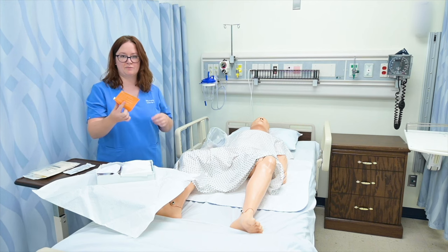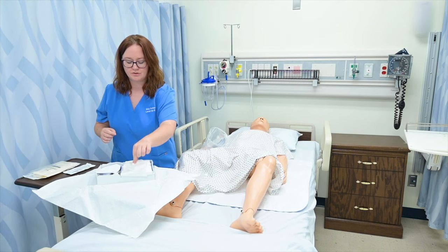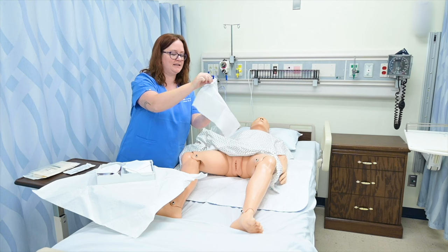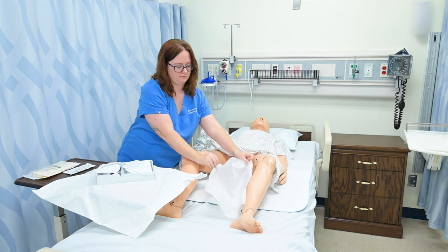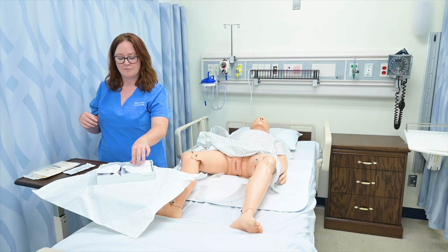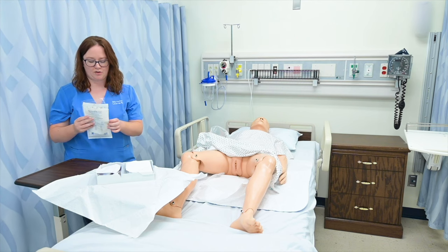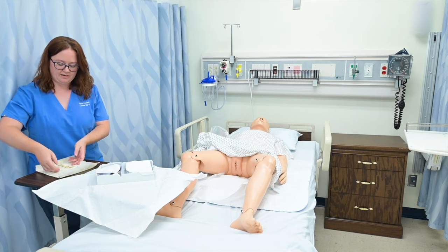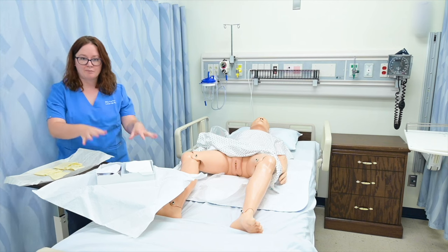These stickers are available to put on the catheter bag itself, so we'll get to that later. We've got our drape that goes down on the bed in between the patient's legs — I'm going to touch just the outside portion, which is the shiny side — and place that under my patient. These kits come with sterile gloves, but I'm going to move these because I like to wear a certain size, so I've gone ahead and grabbed my size of sterile gloves.